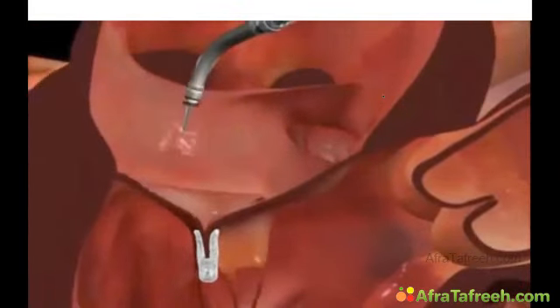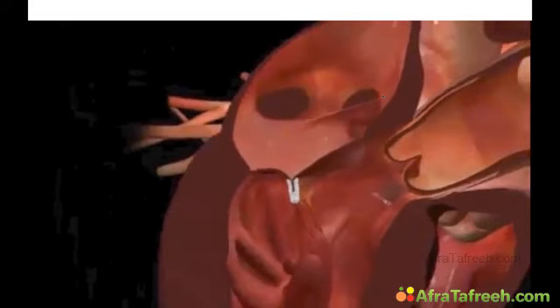But then the device is retracted, you pull it out, and the clip is in place, and the patient has less regurgitation. Now, obviously, this does not always work as nicely as it is shown here. It's a very, very tricky procedure. I just want to give you a few impressions of what happened in this patient to show you what this approach can do, but maybe also to show you which difficulties we have.